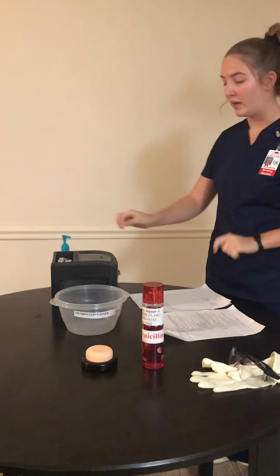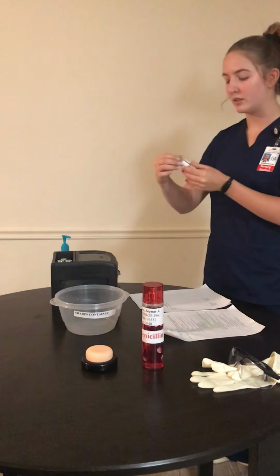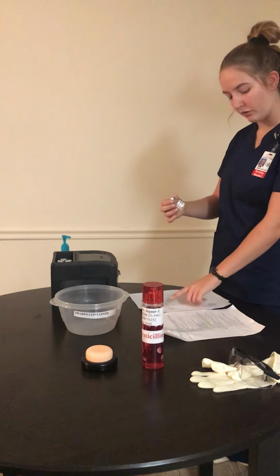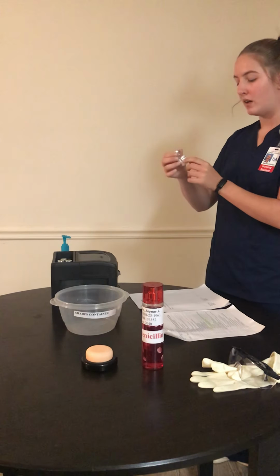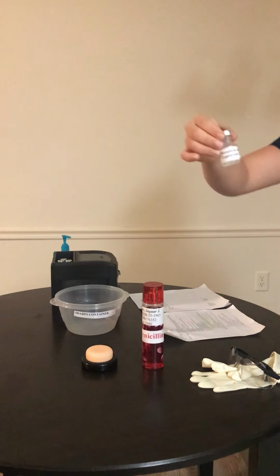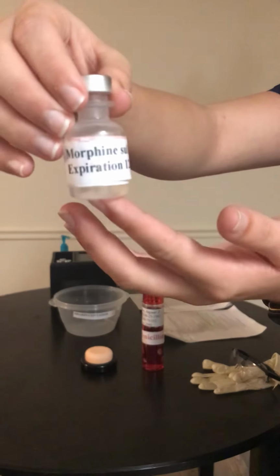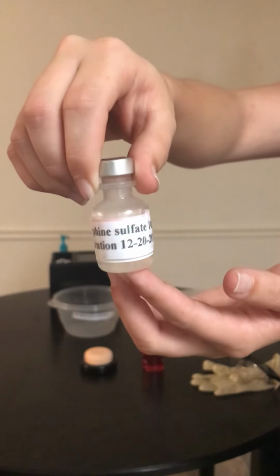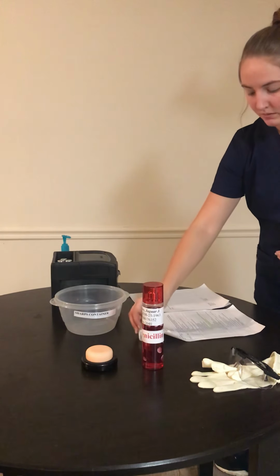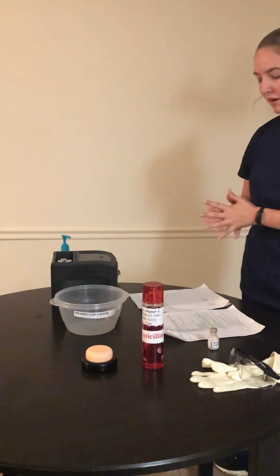After I perform hand hygiene, I'm going to select my correct medication, which should be morphine sulfate and morphine sulfate. The expiration date is 12/20/2020. So it is good, and that is my right medication. I will then proceed to do my 5 rights again.